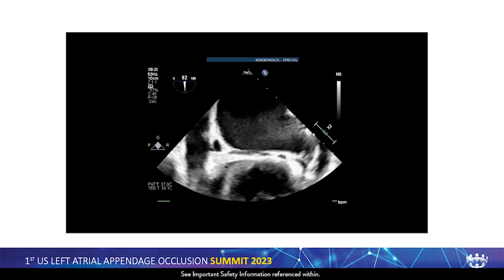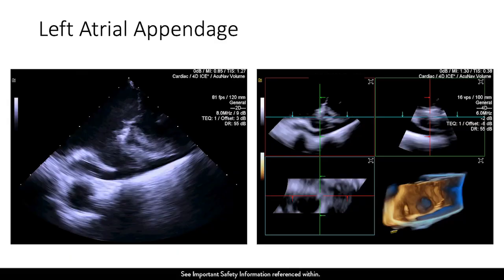Okay. So there you can see our transeptal. This is using ICE. Now, this is a 3D ICE catheter. Remember the 3D ICE, this is a Siemens. Their 2D pictures are not the greatest, okay, but it can function. This is an example of how we use ICE to do transeptal. Of course, the lower you can go, the more inferior you can go, the better it is. This is the ICE sitting in the left atrium, and this is the basic view where the catheter is.